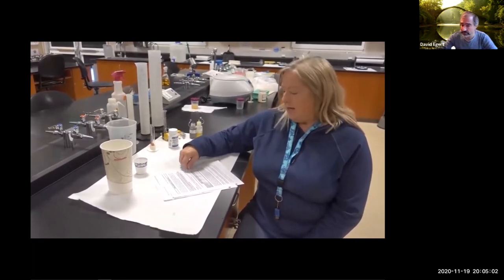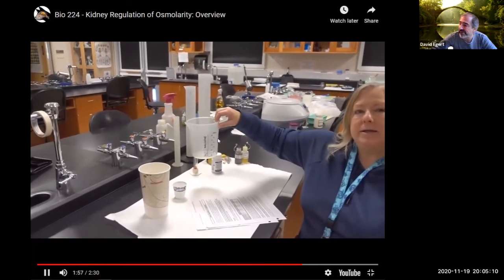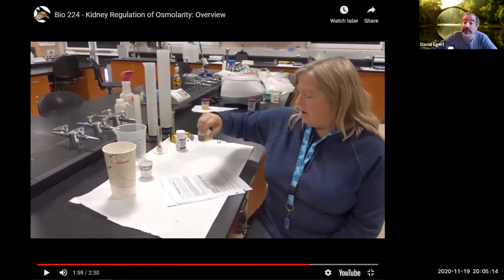And then that'll be time 0. After 30 minutes, students will empty their bladder in various containers using the restroom. Again, it's not going to be a clean catch. This is going to be every last drop, so you can actually get the total volume.